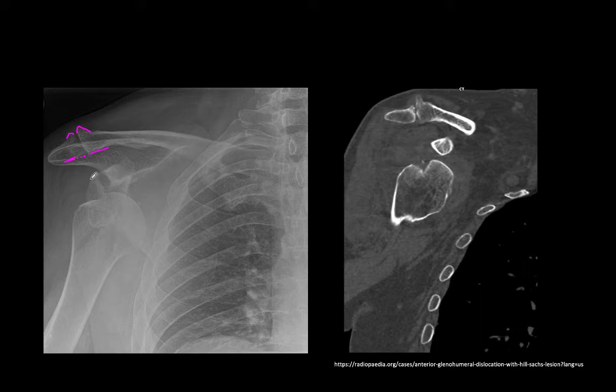But when we look at the glenohumeral joint, we'll notice that here's the glenoid and its articular surface. And here's the articular surface of the humeral head. These couldn't possibly be articulating with each other. Here's an example of a glenohumeral dislocation. Now remember, just based on stats, 95 to 97% of humeral dislocations go anterior. And they have that inferior and medial kind of coupled malposition, right? The humeral head sits kind of below its normal position and more medial than it should, as in this case. This is an anterior dislocation.